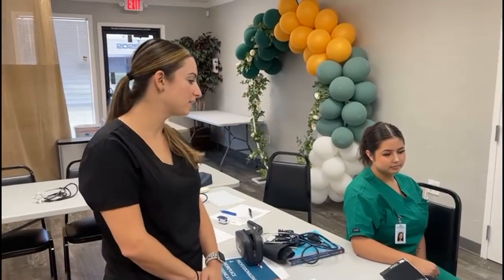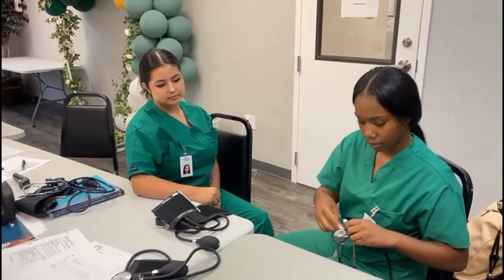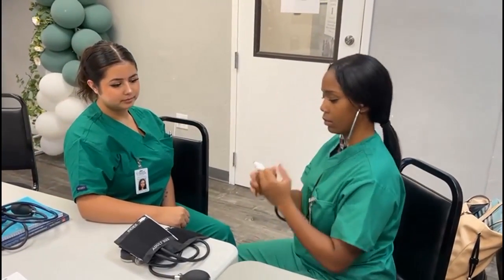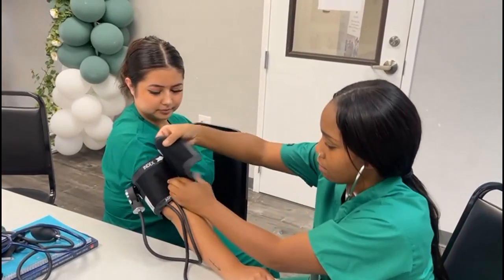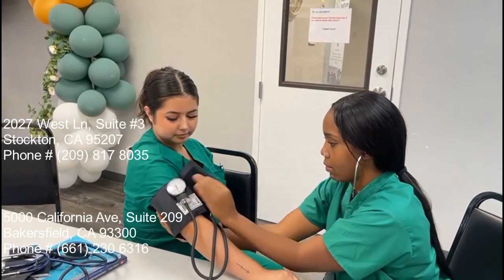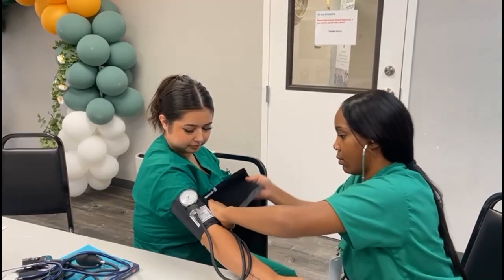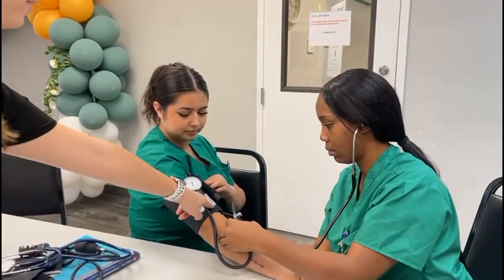We've washed our hands, the patient does not have her legs crossed, and we're going to go ahead and sanitize our stethoscope and disinfect anything. Then you can go ahead and place the blood pressure cuff on the patient. Make sure that this arrow is pointing down towards the artery.